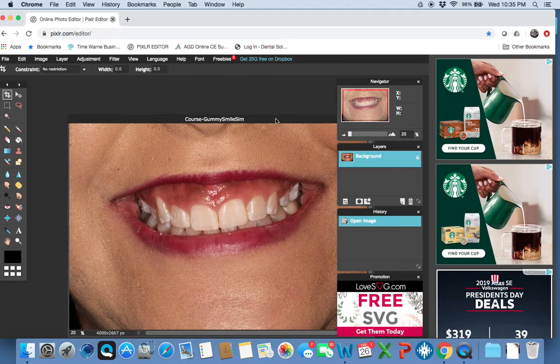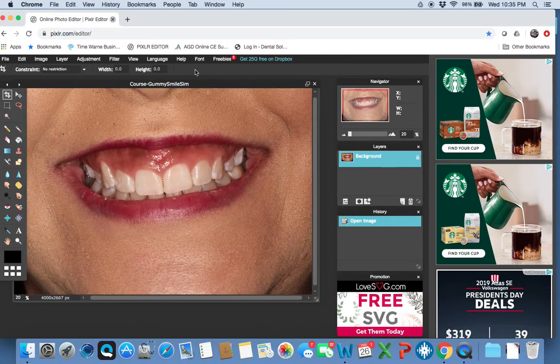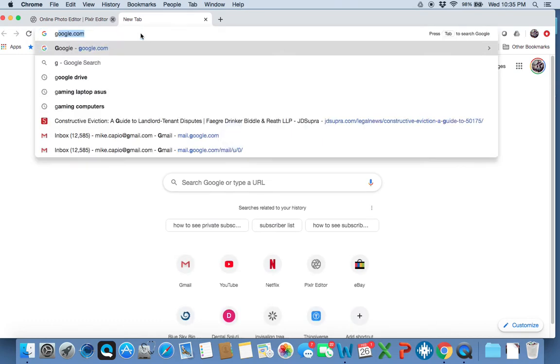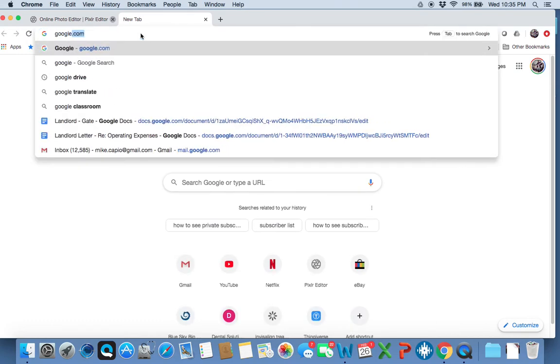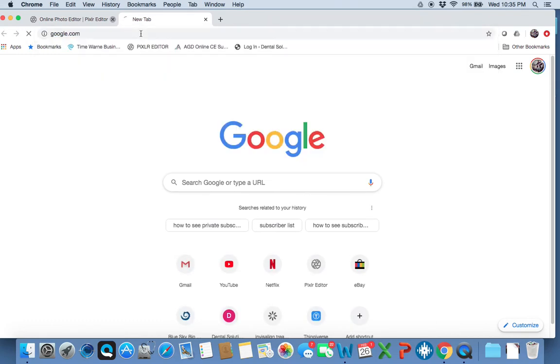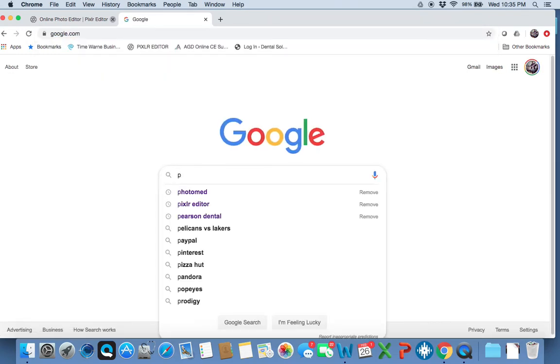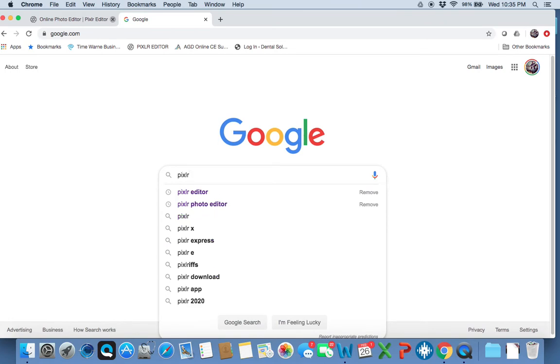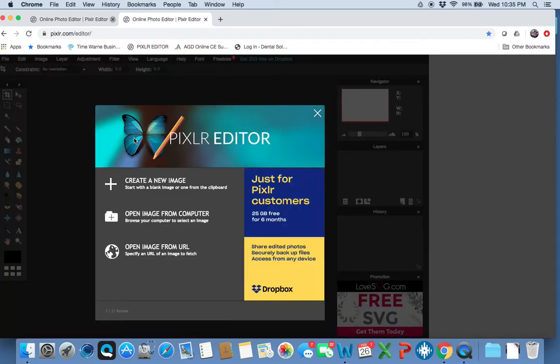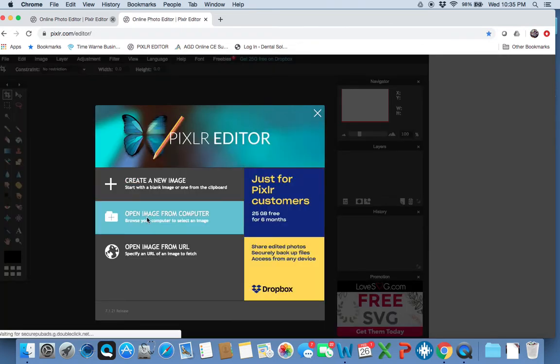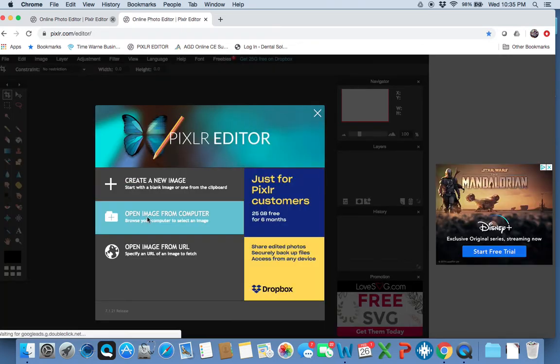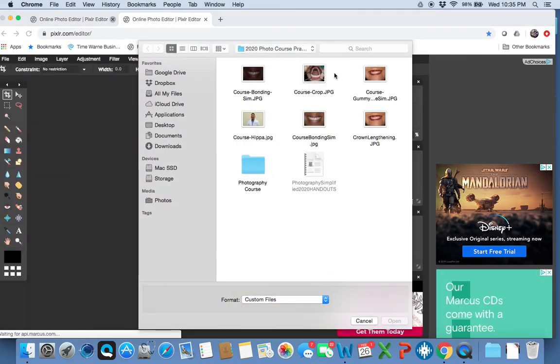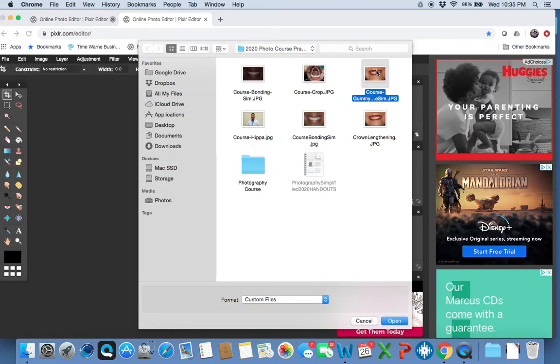I'm going to assume that you know nothing about Pixlr, so you can find it online. It's web-based, and it's P-I-X-L-R, Pixlr Editor. And we'll click on this, and I'm going to open the image.